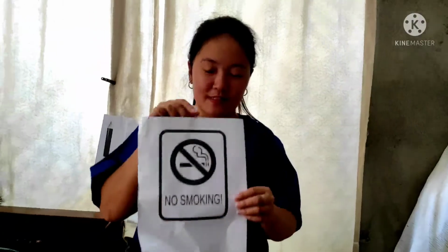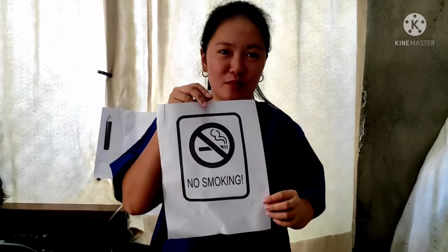Place a no smoking signboard at the entry into the room. The sign warns the client and visitors that smoking is prohibited because oxygen is combustible. This is the no smoking signboard. We put it here.